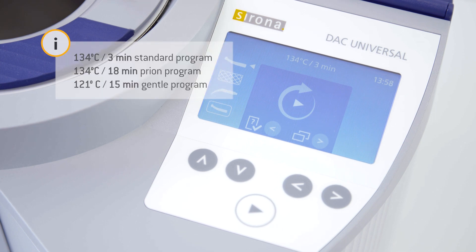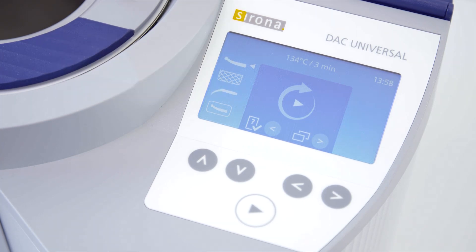Check that you have selected the correct program. If not, this can easily be changed in the submenu. If the standard lid is not yet selected, do this by using the up or down button.